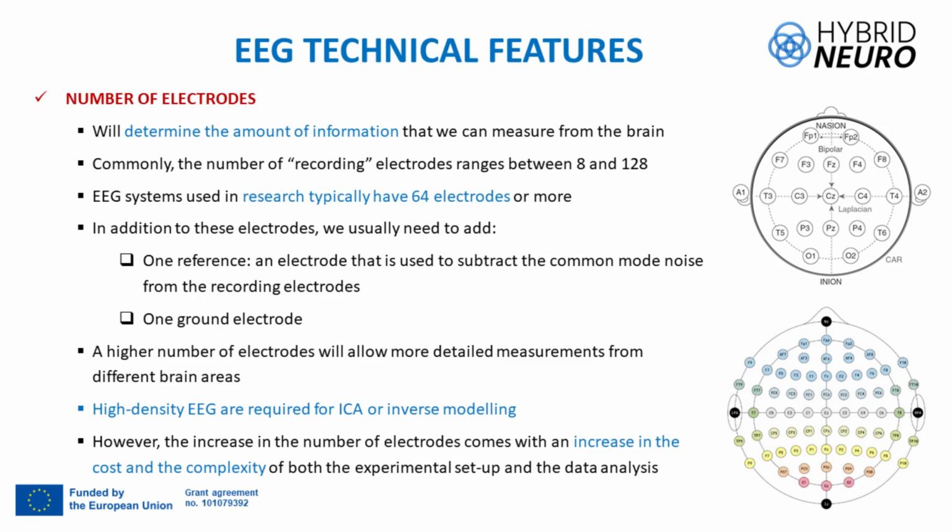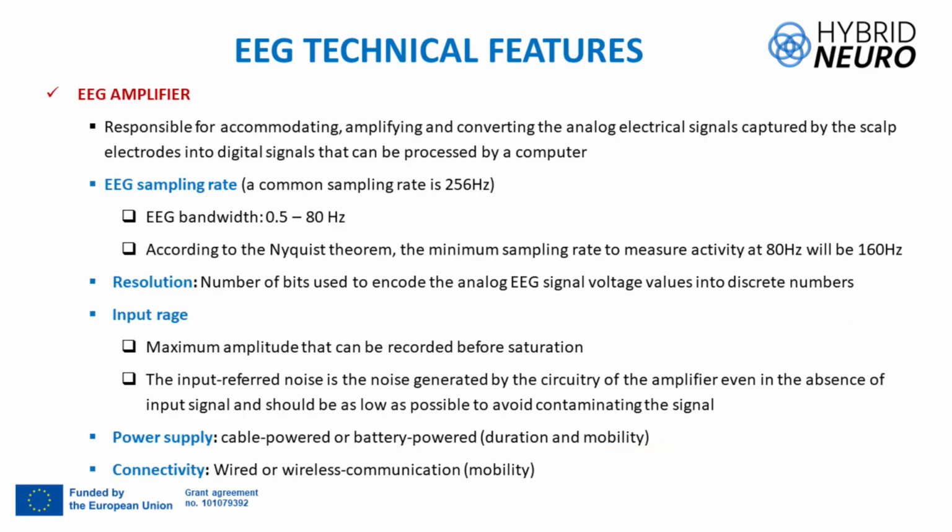So we try to highlight the differences in each electrode with respect to the common average, especially in testing for event-related potentials, later. So, well, it depends on the montage of the acquisition. Well, high input impedance, as you know, etc.